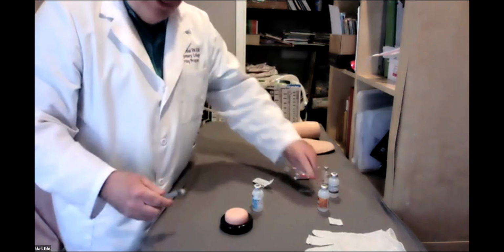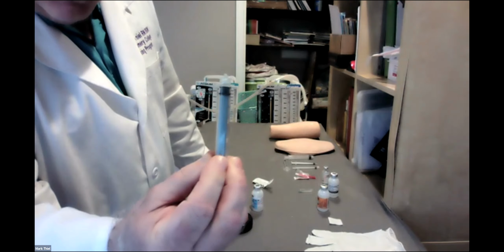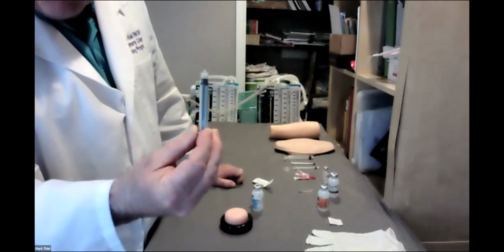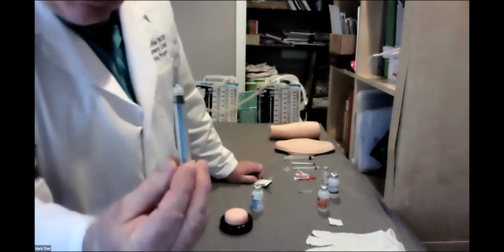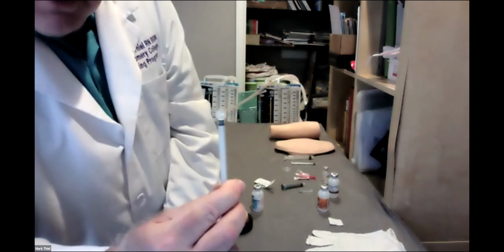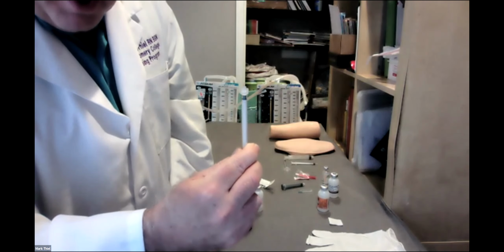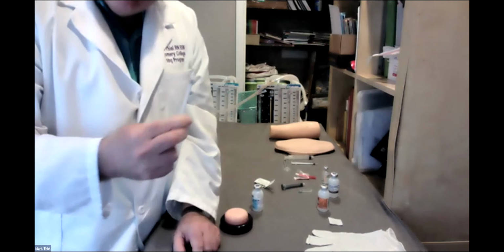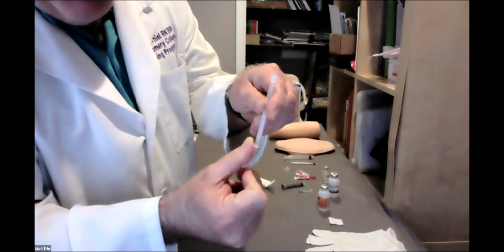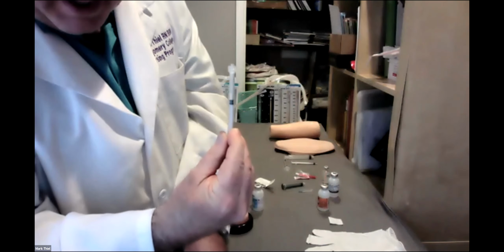Today, what I'm going to be doing, I have picked a 0.5, which I can use on my 3 ml. I'm doing this so that you can visualize it a little bit better. What's another choice of a syringe that I can use? The 1 ml, again with the luer lock tip. Actually, I'm going to change my mind. I will demonstrate this because a 0.5 is very easy to draw. Half the syringe is very easy to draw on this one and see.